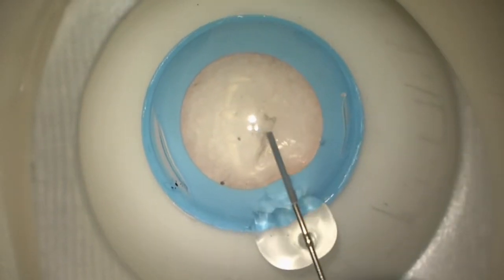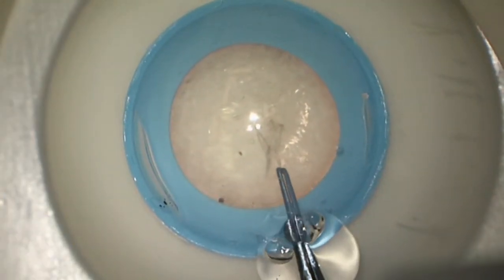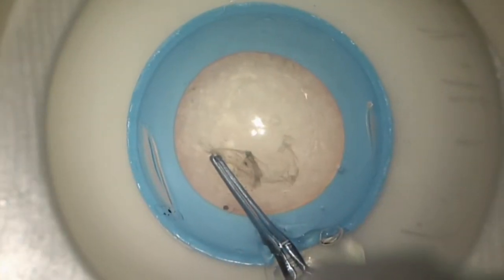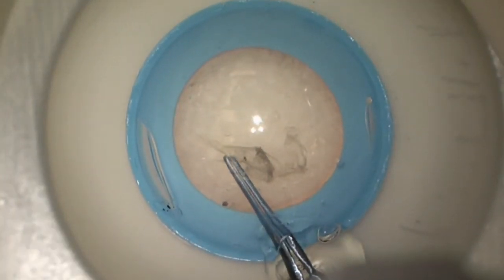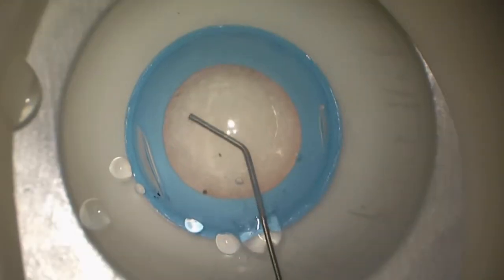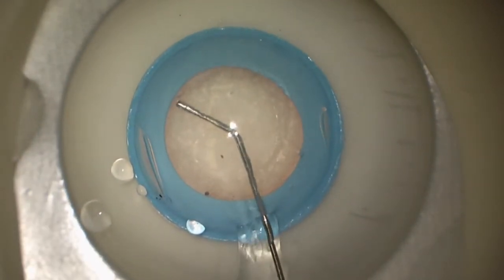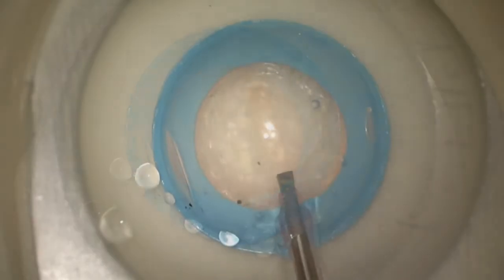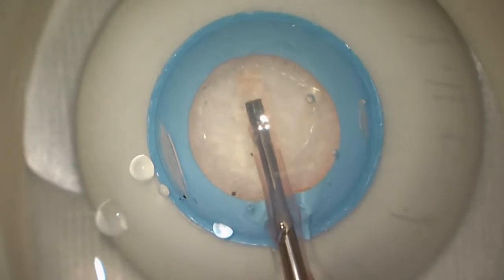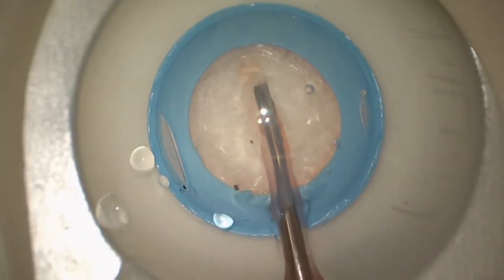Initially with a cystotome and now with capsulorhexis forceps. In this case, Austin Fox, who was one of our chief residents at the time, was able to do a nice continuous rhexis under the tutelage of Tim Johnson, who is our chief of cataract surgery at the University of Iowa. We got these eyes during COVID with the leadership of Jackie Hogsdale, who is our chief of simulation here at the University of Iowa — a wonderful physician and a leader in the area of simulation.